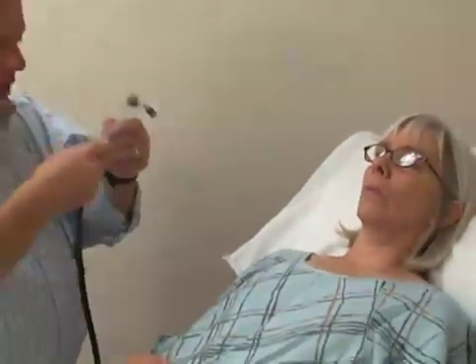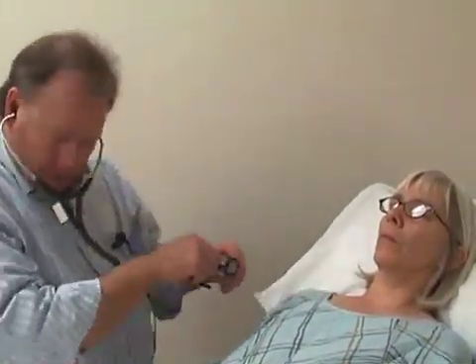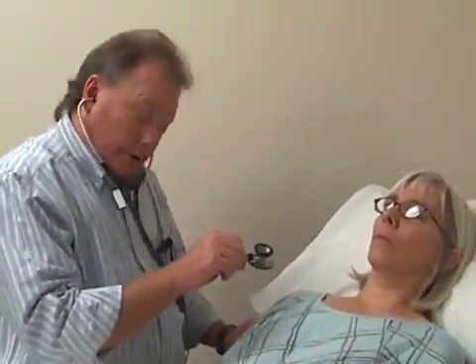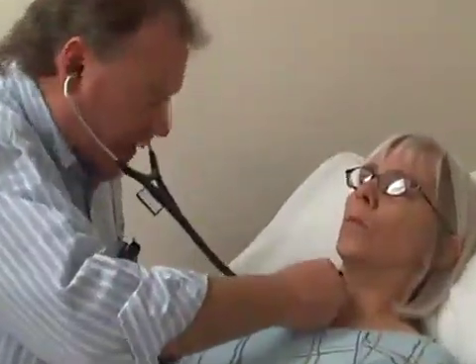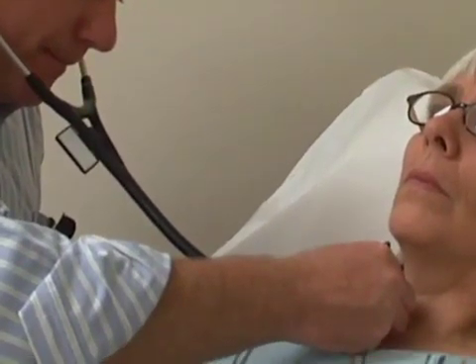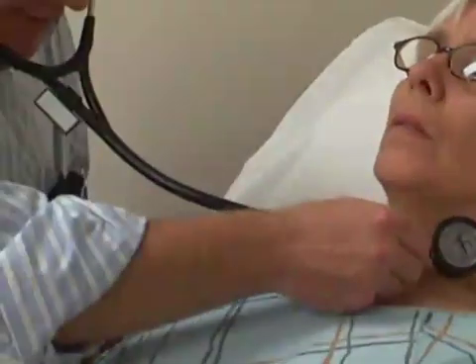And then next, we're going to auscultate the carotid pulses, this time using the bell portion to be able to hear the lower frequency sounds. In order to do this, you have to instruct your patient to take a deep breath and hold, and I'll do the same. And exhale. And the same thing on the other side.